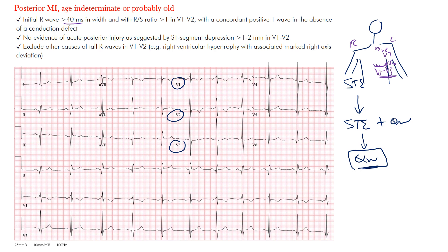What we want to see is an initial R wave that is at least 40 milliseconds in width in V1 and V2. The width of the R wave — from the start to where you see the inflection point — should be at least 40 milliseconds, which equals one small box. Another thing to note is notching; notching tends to be a pattern of scarring in that portion of the ventricle.